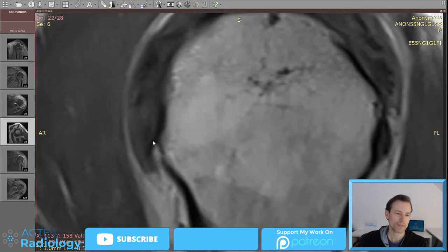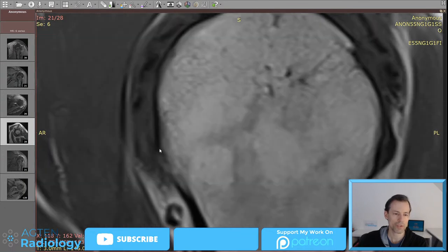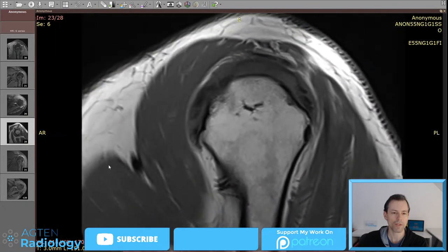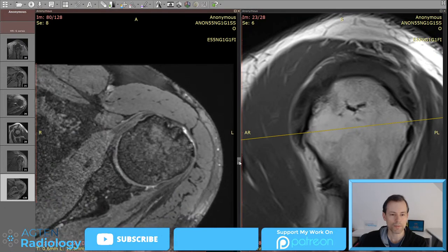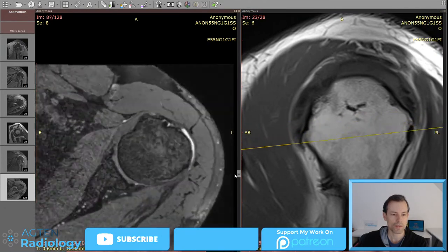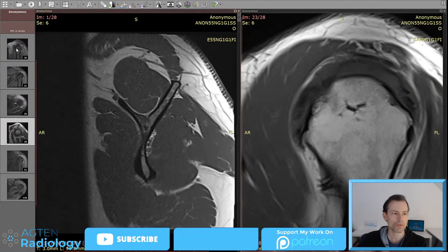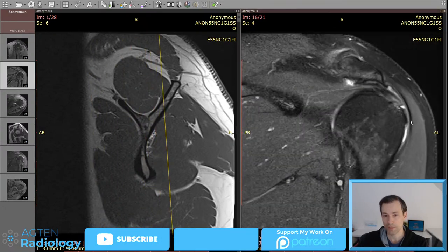And this is not tendon, so it's there, then it's going, because the most inferior portion is typically just the muscular insertion, and this is probably a tiny bit of calcific tendinitis or hydroxyapatite. But the bursitis is most likely not caused by this. I think that's just a coincidental finding. Now, why does he have bursitis? This is also something we should try to figure out. And why he has the tear in the first place, right?